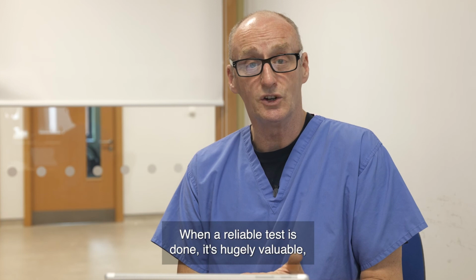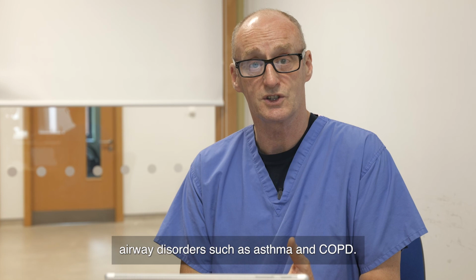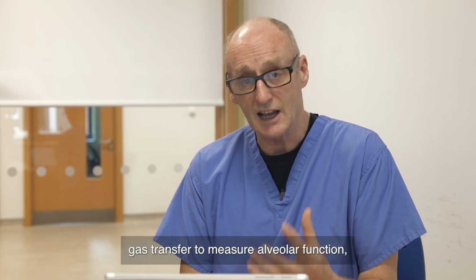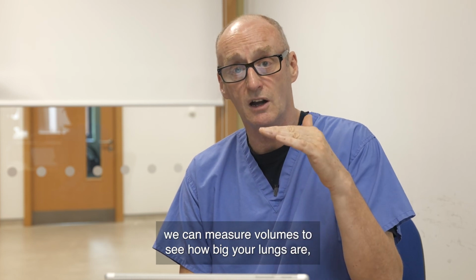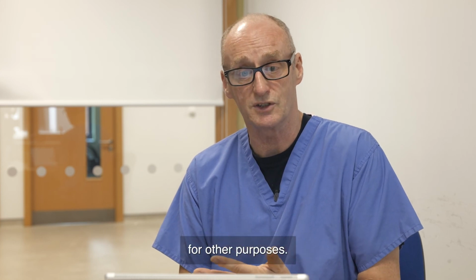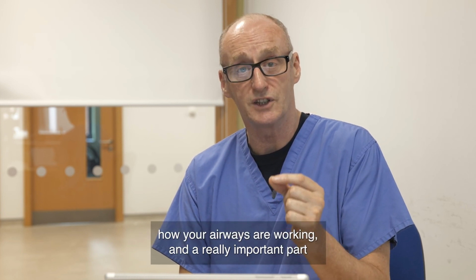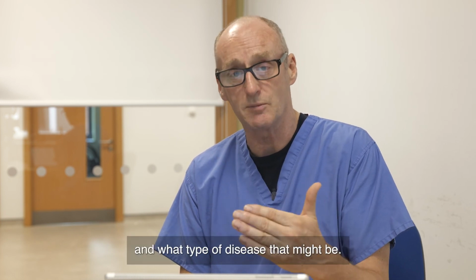When a reliable test is done, it's hugely valuable, particularly in determining whether people have airway disorders such as asthma and COPD. Of course, there are other ways that we measure other parts of your lung function. Gas transfer to measure alveolar function. We can measure volumes to see how big your lungs are. And then we use radiology, chest x-rays and CT scans for other purposes. But spirometry is the key test to tell us how your airways are working, and a really important part of the toolkit that we use overall to work out whether you have any lung disease and what type of disease that might be.